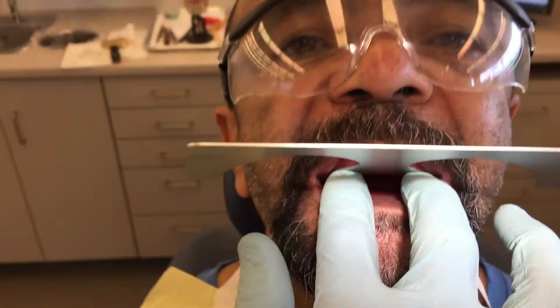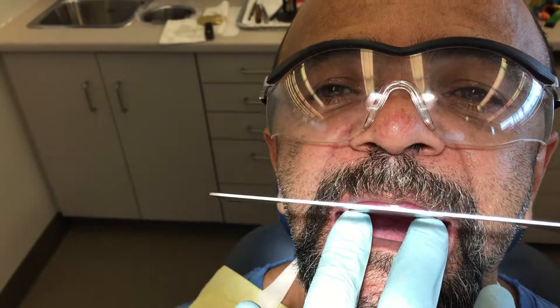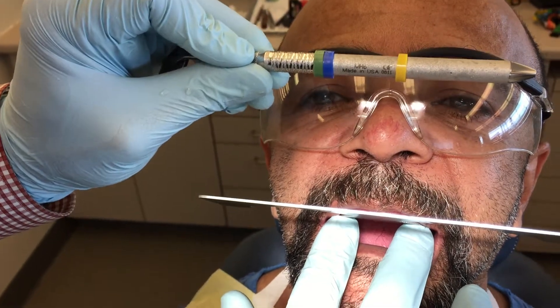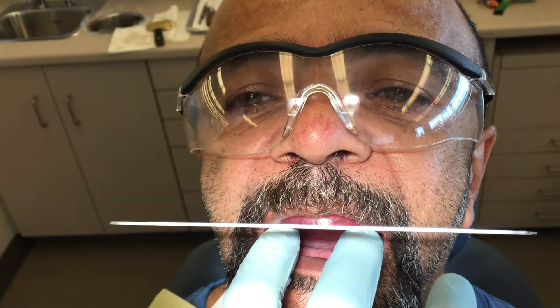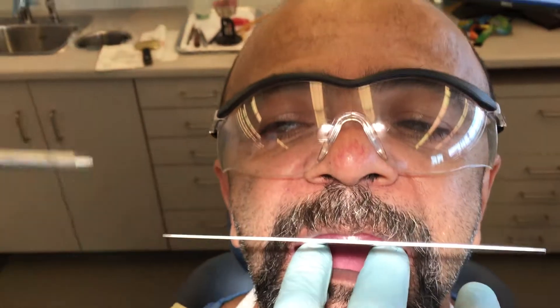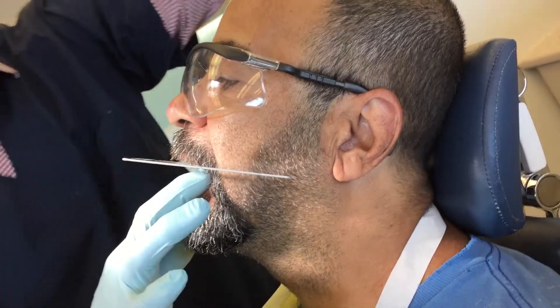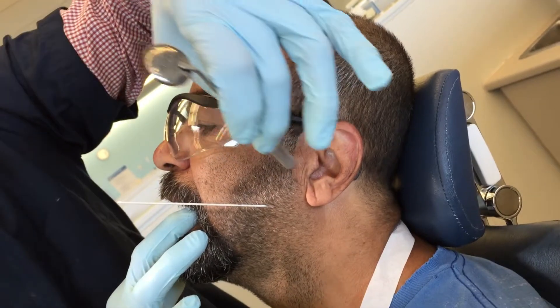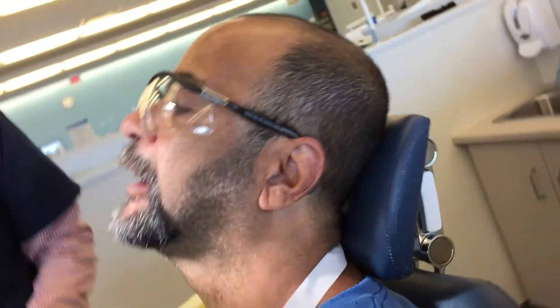I'm going to place in the Fox plane, and that looks a whole lot better. I have a nice parallelism now between the interpupillary line and the Fox plane itself, which corresponds to the plane of occlusion. Looking at it from the side, I can see that I am parallel to the inferior border of the ala to the middle of the tragus. You want it parallel to that imaginary line — and that looks pretty good. I'm really confident with what I've established here so far.